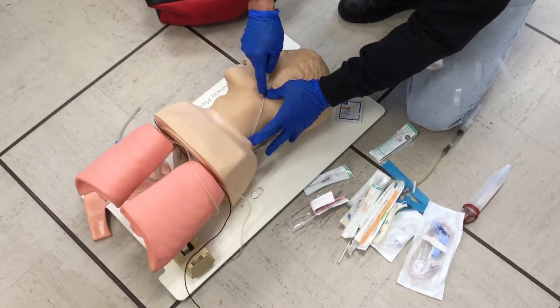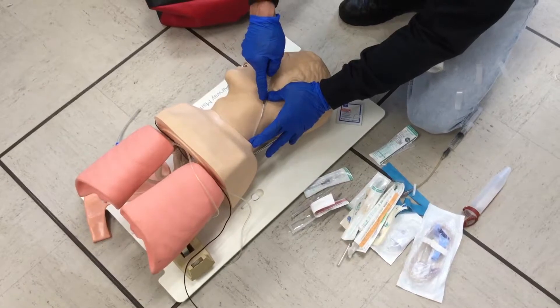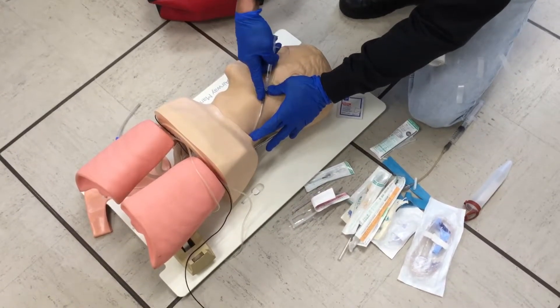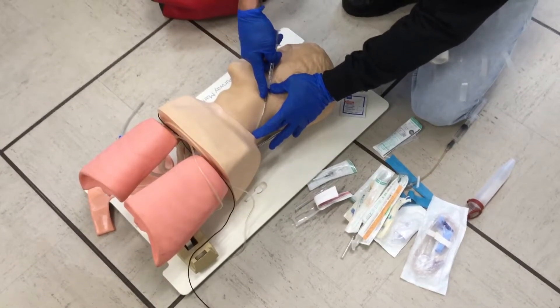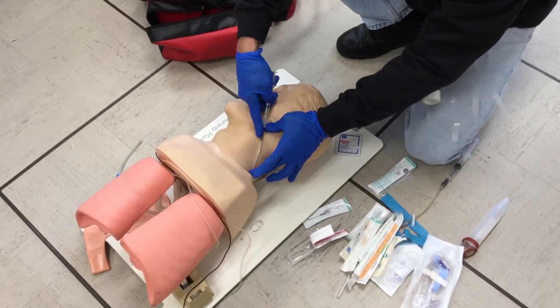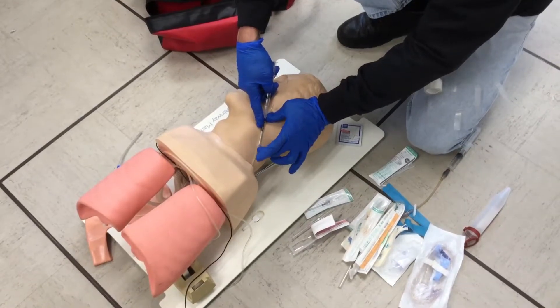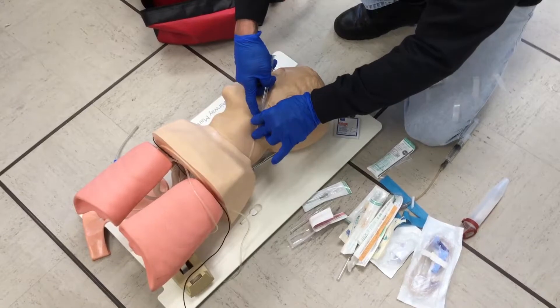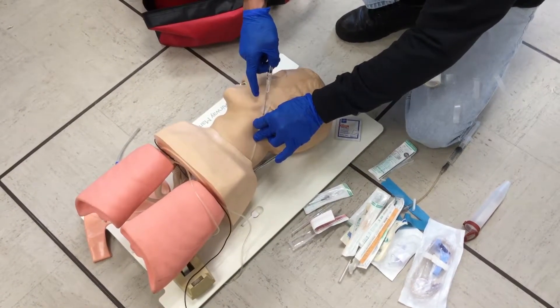You've got to run your fingers back so that you can pull on the plunger and confirm that you've got blood return. As you have blood return, you can advance a little bit — see and test if it goes in. It should go in nice and freely. Advance all the way. I'm drawing back on the plunger so I have venous return — I have blood. Now I'm going to release the tourniquetting with my fingers so that I can find that spot before I release the traction. I want to still pinch that so I can move my fingers around — it pinches off the skin. Now I can pull the needle out.